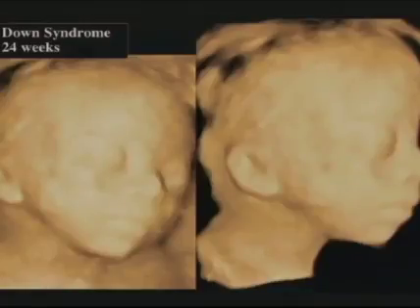Here is another fetus with Down syndrome, and in this case the ear is probably not necessarily small, but it's very low set and rotated forward. The bottom of the ear is rotated forward, which is also quite abnormal. And the dysmorphologists have a lot of information and experience in diagnosing low-set ears and in knowing what that means and what the syndromes are that can be associated with low-set ears.